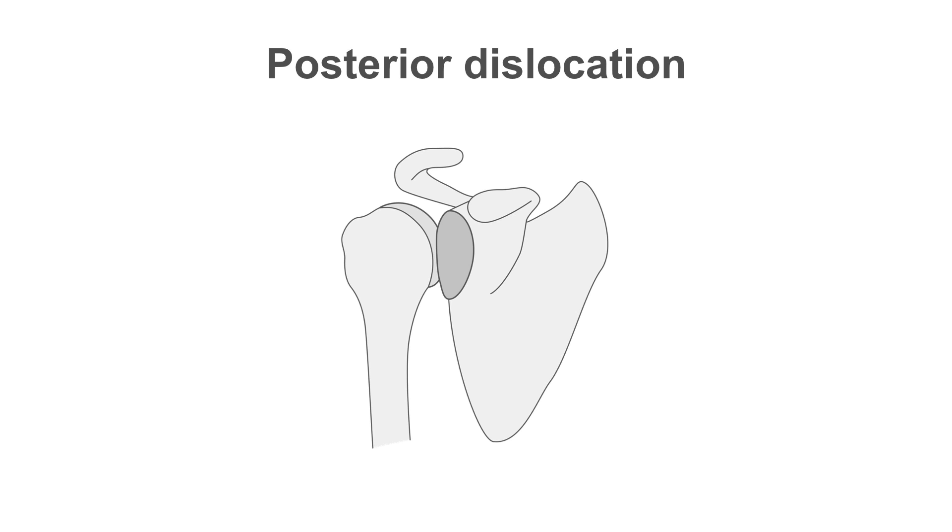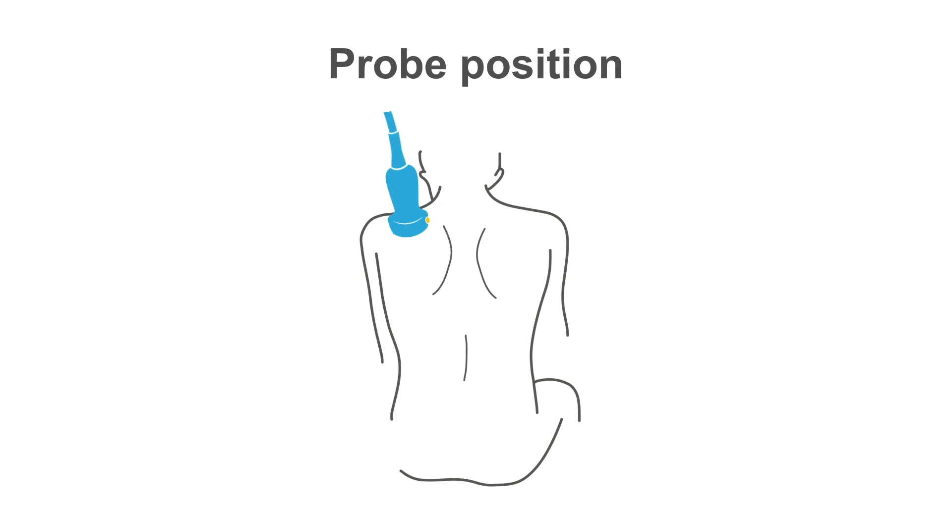In terms of probe position to locate the shoulder dislocation, your probe will be located in the posterior aspect of the shoulder joint along the scapular spine. The best way to do this is to have your patient try to sit upright. I know it's hard sometimes, but talk them through it and shrug their shoulders back. This ergonomic good posture position creates anatomic consistency. It's also incidentally the position to have your patient in for their subsequent reduction procedure.